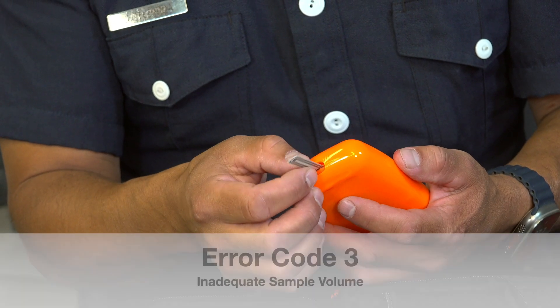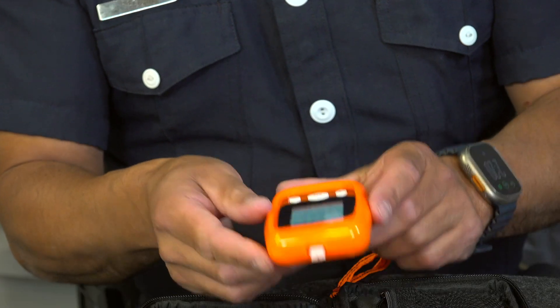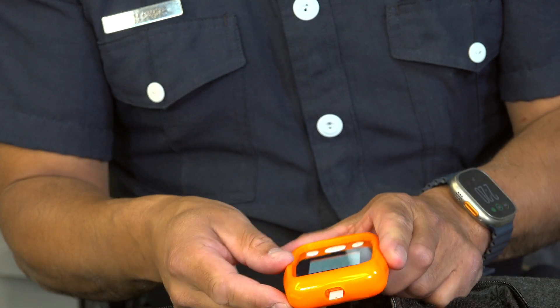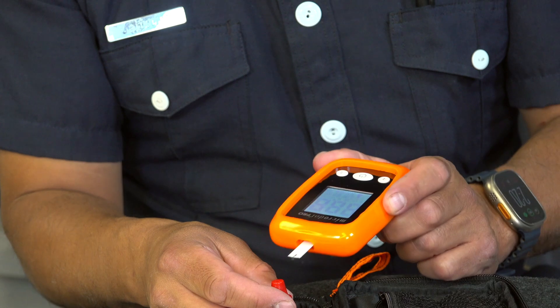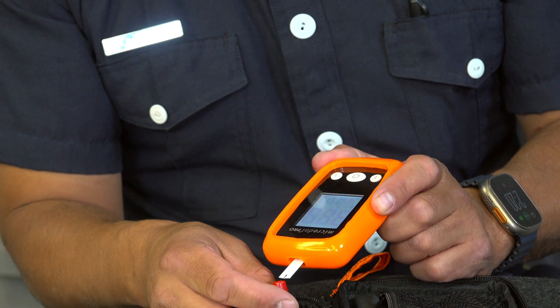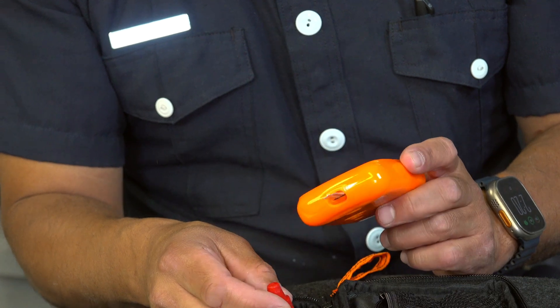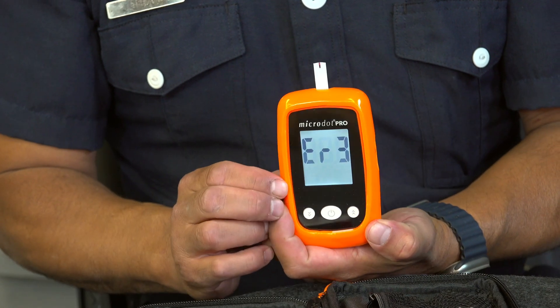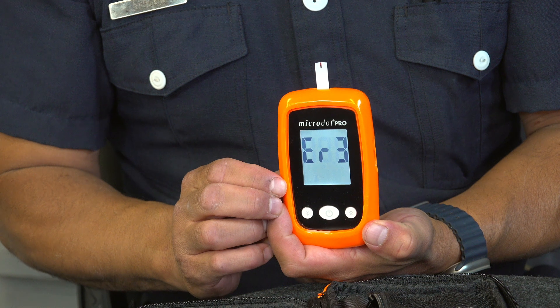Error code 3: I'm going to give an example of what happens, which is obviously not enough blood on the lancet strip. You enter the strip in, you're ready to collect your blood. Here's my example — I squeezed out as much blood as I can, and now I'm going to try to obtain my sample. As you see, it seems like it drew the blood, but it did not, and immediately gives you error code 3. You have to re-enter a new lancet and get another sample from that point.